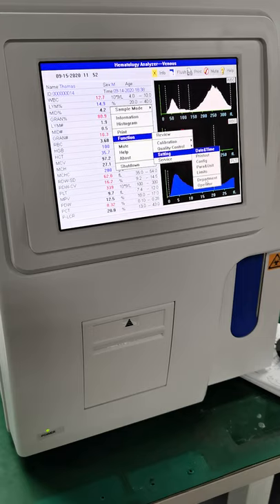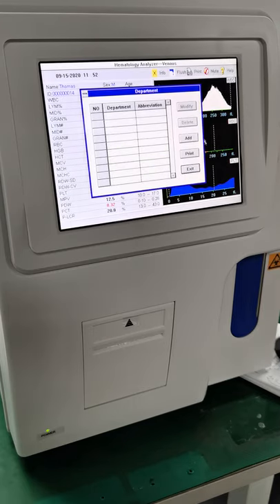And we go to this department now, okay? So in this part, we can just add some departments like surgery, internal medicine, gyne ops, or pediatrics, infectious disease, or whatever, in emergency, whatever departments we have, okay? For example, I'm gonna do three departments, okay?